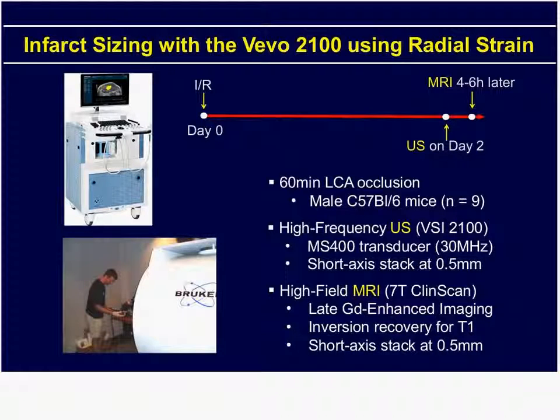It was the impression that the 400 was the preferred cardiac transducer. I think that we do have a 500. I don't know that we performed a rigorous side-by-side analysis, but I think that our ability to see the posterior wall was adequate with the 500. It certainly depends on the model as well. Some of these MI models can be more challenging, and the 400 definitely gives the better image quality that you need, certainly as you go deeper, as you say, on the posterior wall.